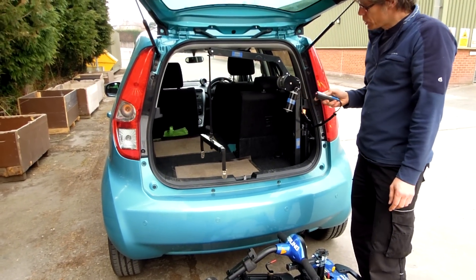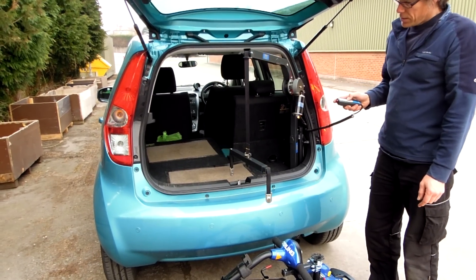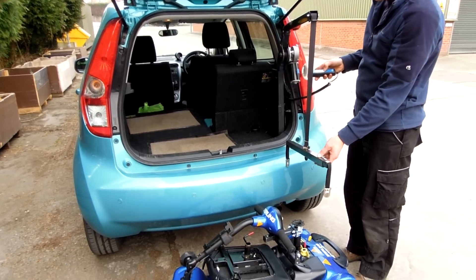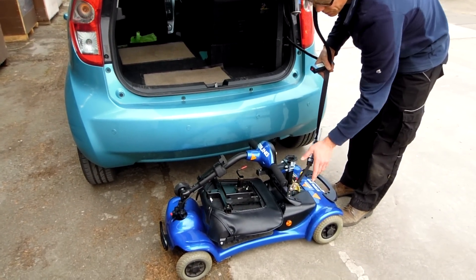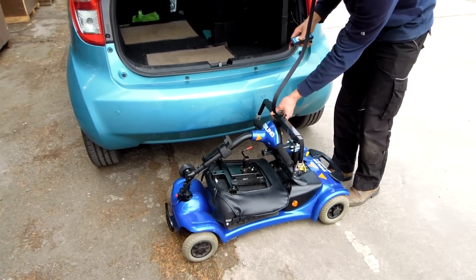It's a four-way hoist so it's got the in and out power and the up and down as well. It's all done by the handset here. Power that down, connect those little brackets onto that on each side.